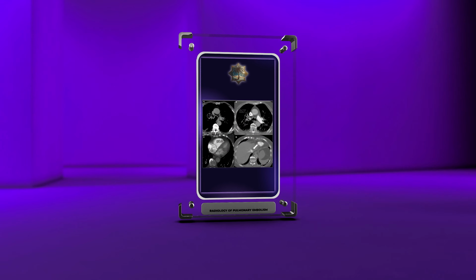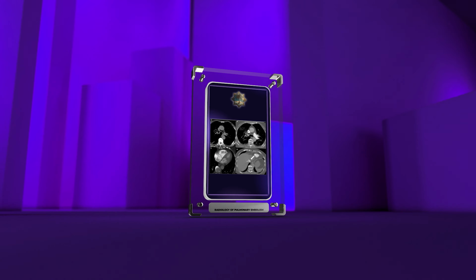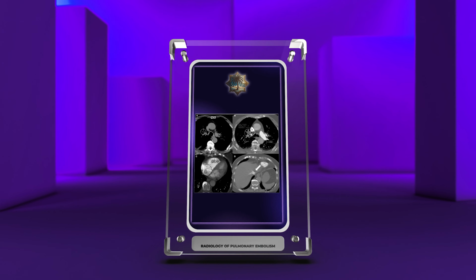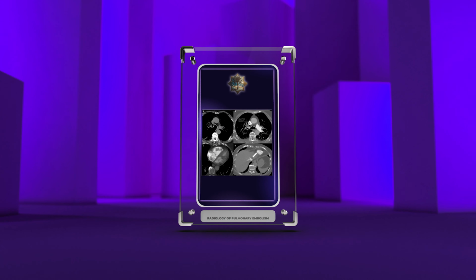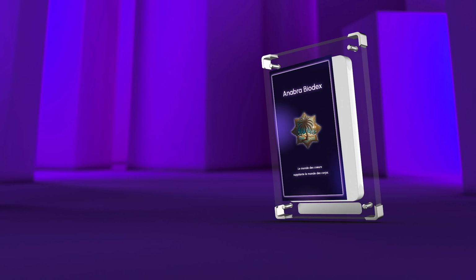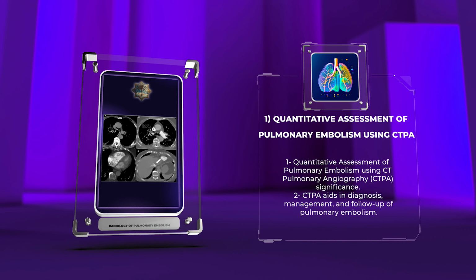Ladies and gentlemen, esteemed medical students, welcome to today's lecture on the complex and fascinating topic of pulmonary embolism. In this comprehensive script, we will delve into the various aspects of pulmonary embolism imaging, diagnosis, and treatment. So let us embark on this journey of knowledge as we explore the exciting world of radiology in relation to this life-threatening condition.